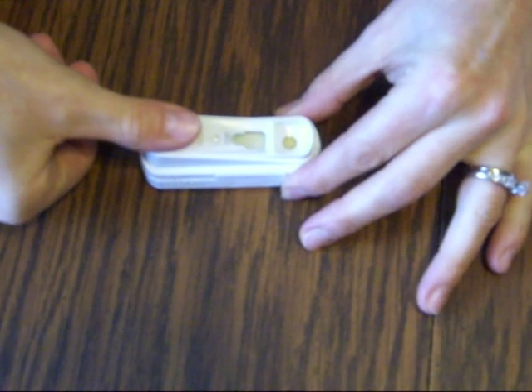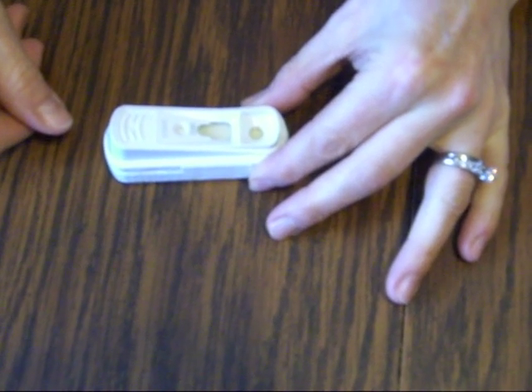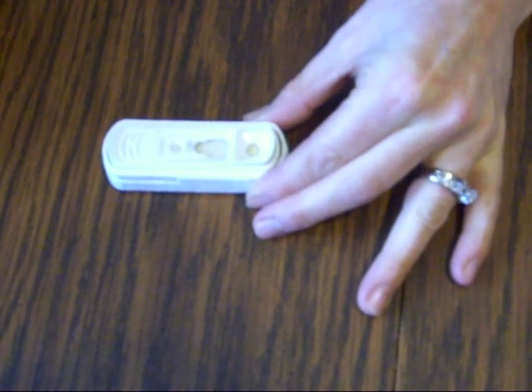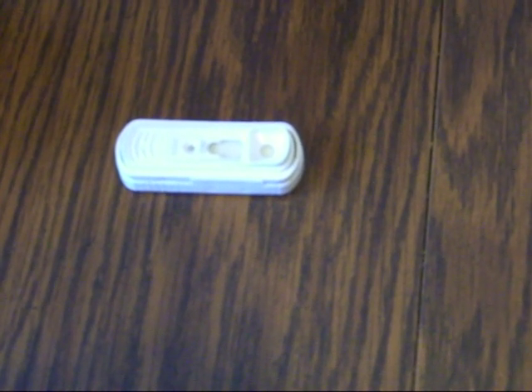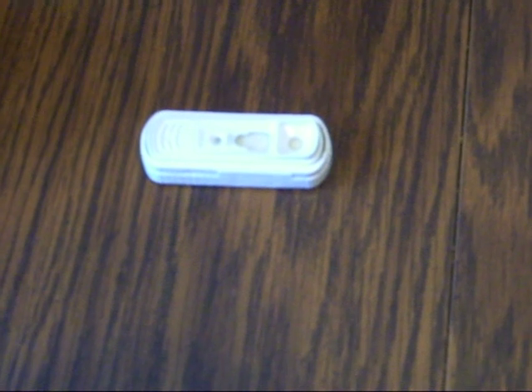When the liquid shows up in this window, I'm going to push down here with my thumb. Then you just wait for your results — you'll want to wait about ten minutes and you should have your results. I will take pictures to show what the results look like.